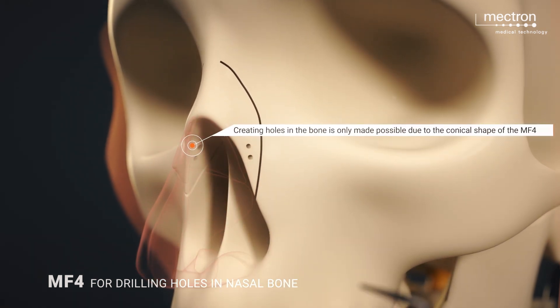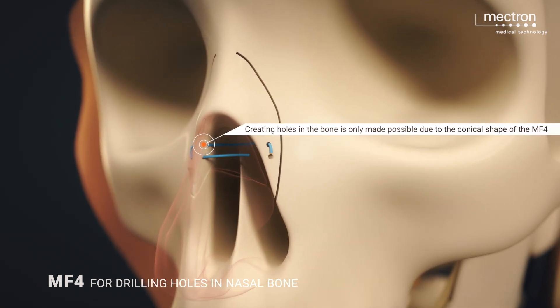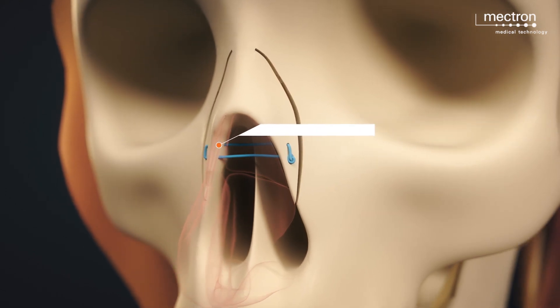This allows for a horizontal bone suture with absorbable suture material that fixes the lateral walls in a medialized position.